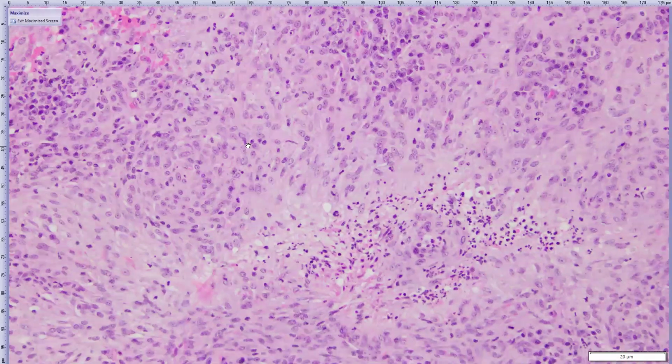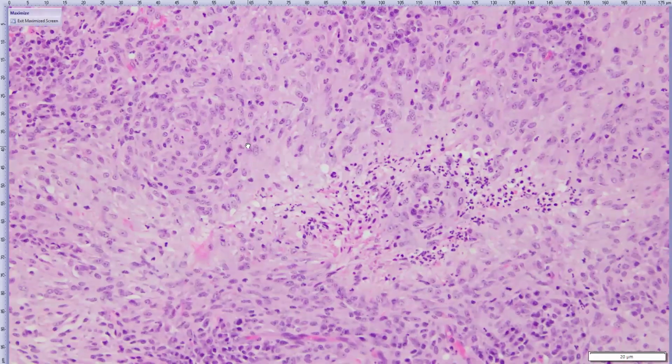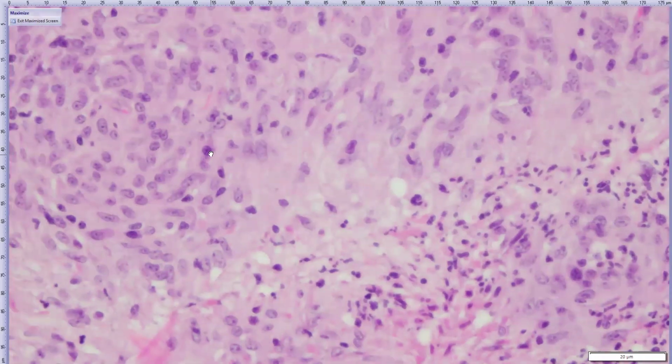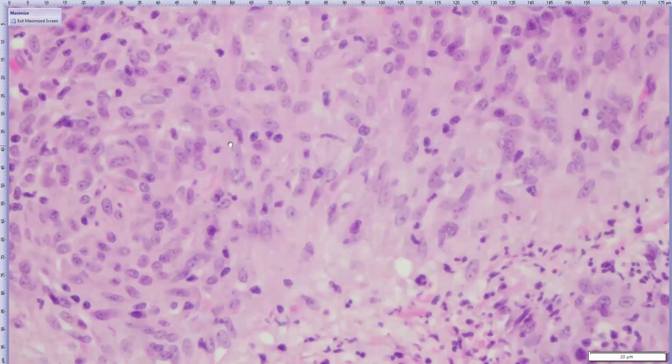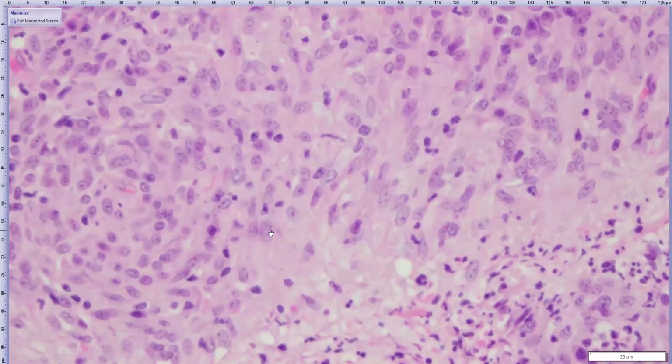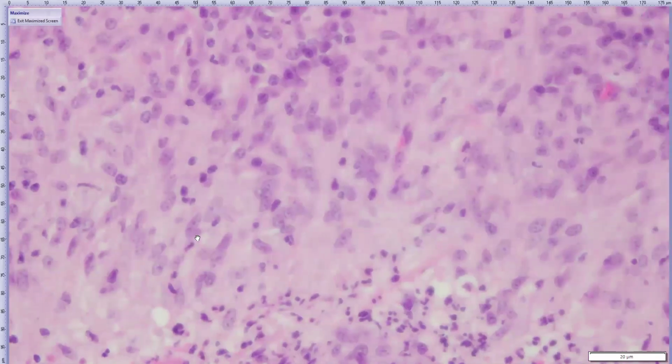This is an inflammatory population, not neoplastic, and it is predominantly composed of macrophages. So all of these cells here are macrophages. Let me go one closer. It's kind of hard to see their borders. These are more epithelioid macrophages, so they're not really the distinct round cells that we see with other macrophage populations. But these nuclei are very macrophage-esque. They are oval, sometimes a little indented. They have coarse chromatin and multiple nucleoli. They look like little potatoes to me. Just how I think of macrophages.